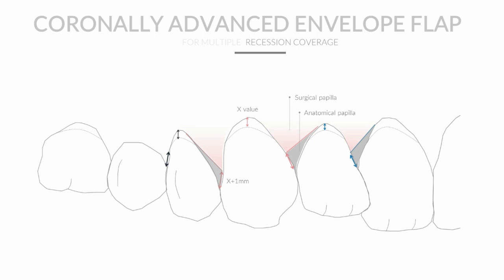The second premolar is subject of discussion, since no recession can be seen on this tooth. Zucchelli has described what he calls a false recession technique to overcome this problem. This consists of a paramarginal incision mimicking a recession defect. This false recession is then treated as a real recession and connected to the margin of the molar and premolar.